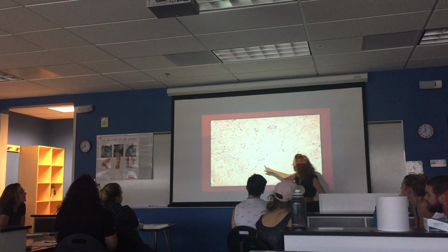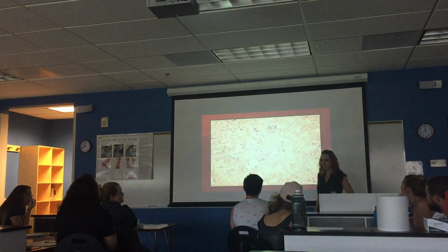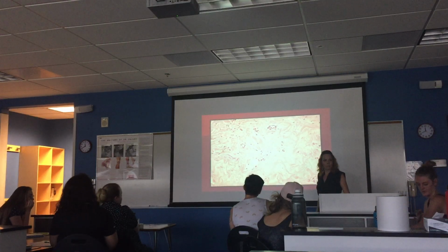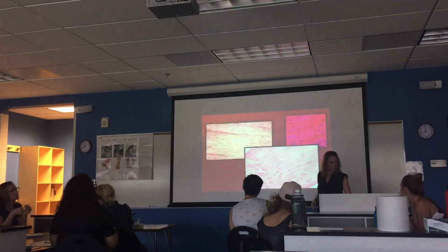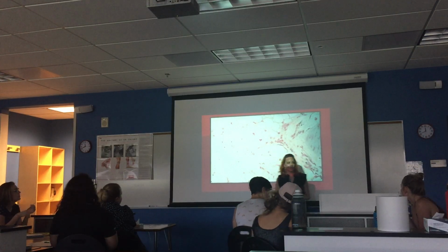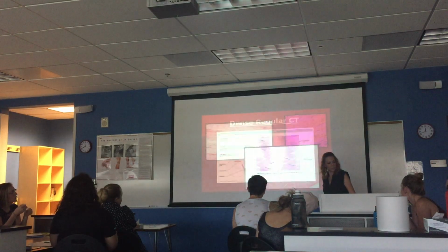Probably maybe adipose. Adipocyte. Sure, if it's lining the blood vessel that's going through the dermis. Again, nothing occurs all on its own out there. There's blood vessels in the adipose. This thing is full of blood vessels, all over the place. Form indicates function. Why would we have a crap ton of blood vessels going to adipose tissue?